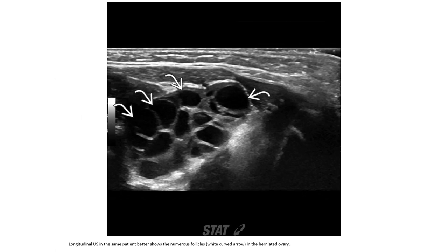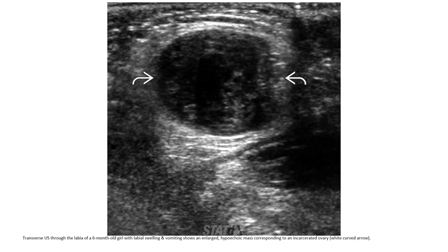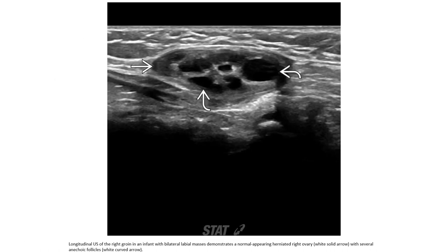Ultrasound in the same patient better demonstrates the numerous follicles in the herniated ovary. Another ultrasound through the labia of a six-month-old with labial swelling and vomiting shows a large hypoechoic mass corresponding to an incarcerated ovary. Ultrasound of the right groin in an infant with bilateral labial enlargement demonstrates a normal-appearing herniated ovary with several anechoic follicles.